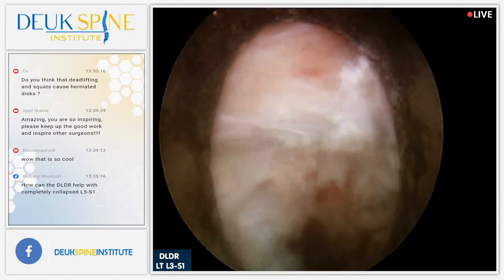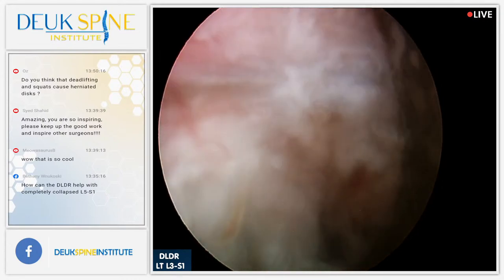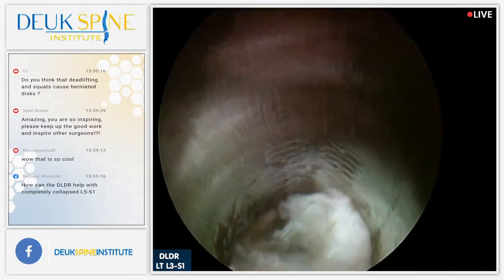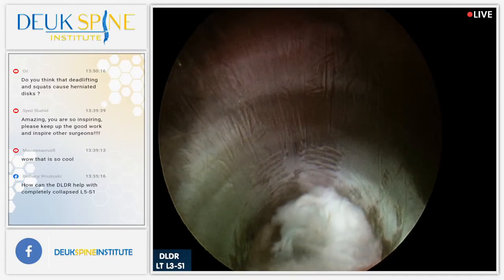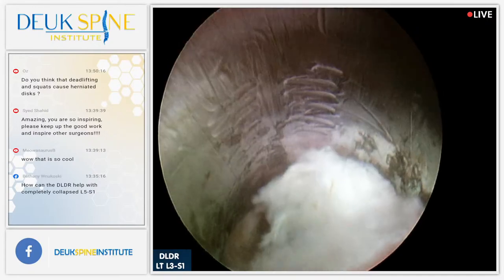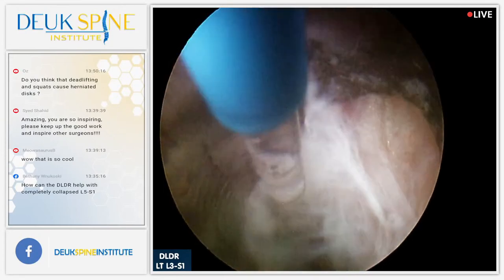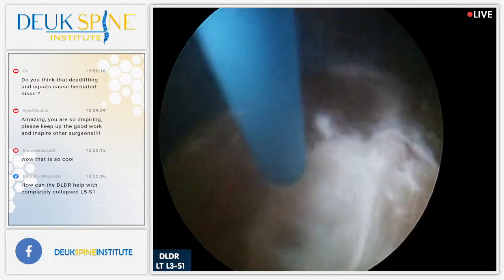Let's see if we can get 3 out of 3 nerves. Nope. I can't see a nerve in there. All right, I got to get a little more of that disc right there. Last piece of disc. So we got 2 out of 3 nerves. That's still better than most patients. Normally we don't see the nerves. They're hidden in fat.